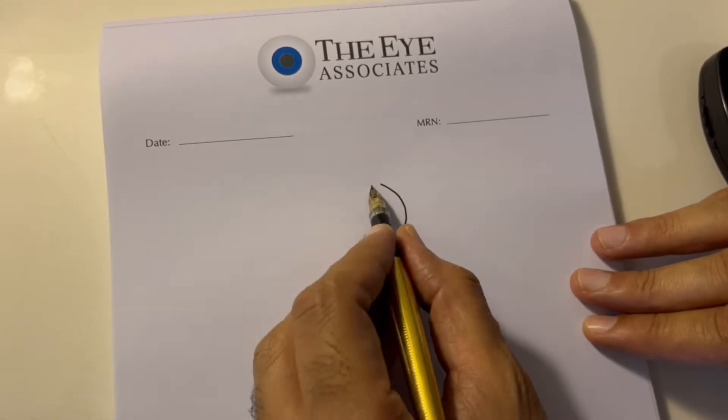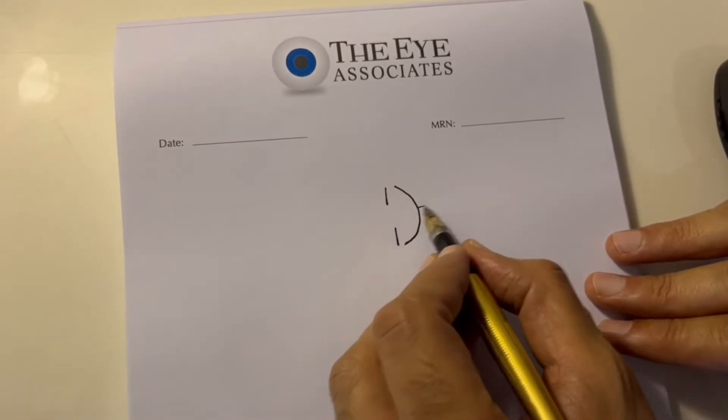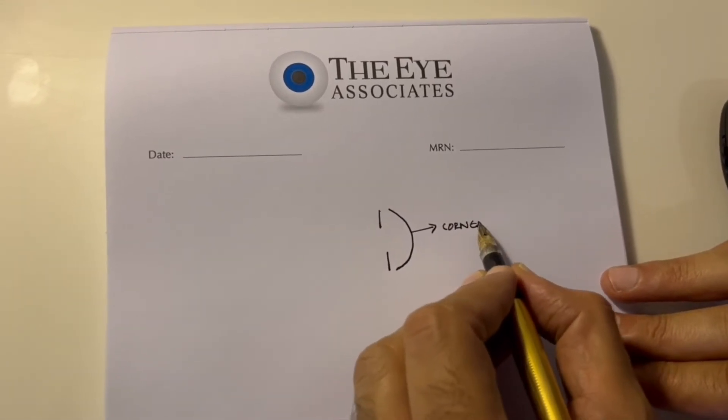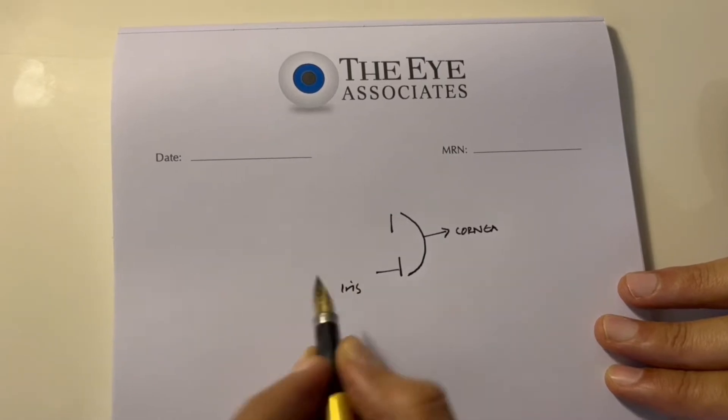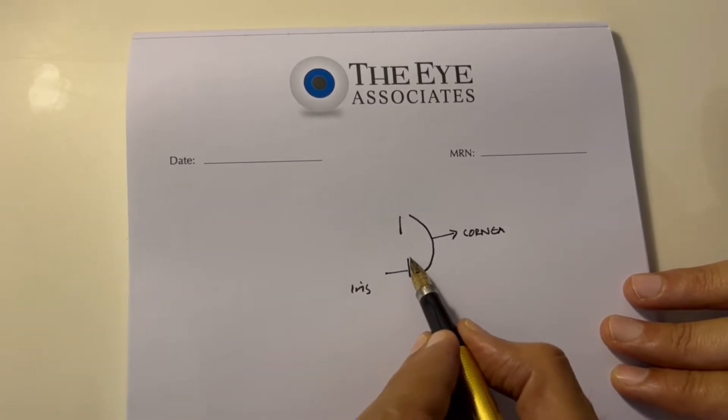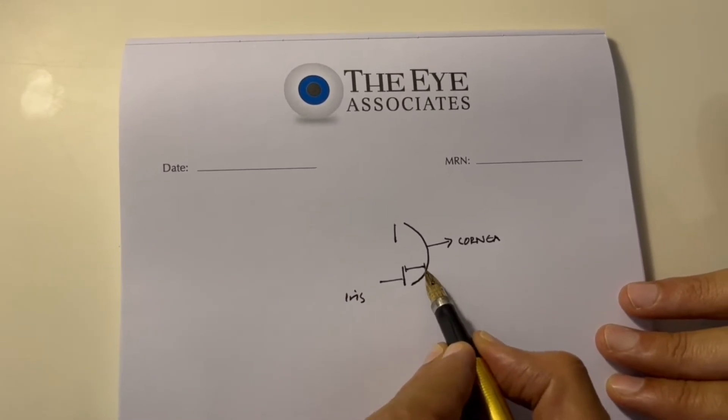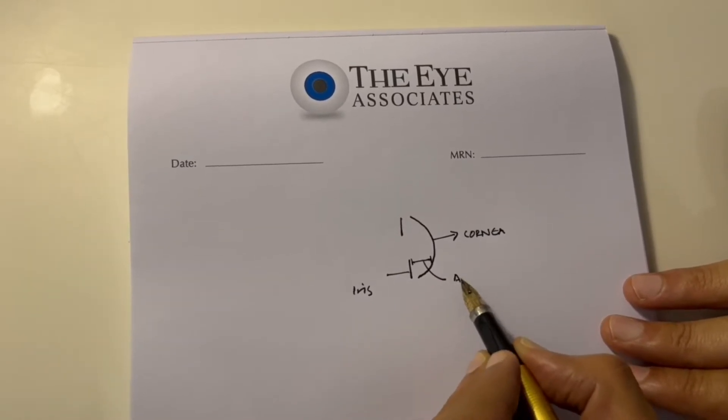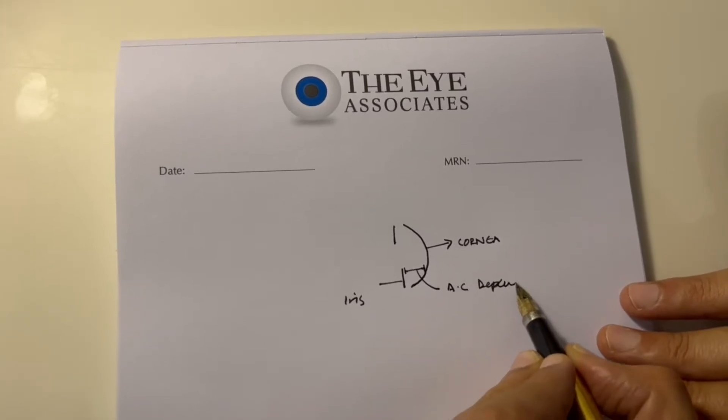you'll be able to appreciate the crescent of the cornea and the brow of the iris. You basically guesstimate the distance between the cornea and the iris, and that is the anterior chamber depth.